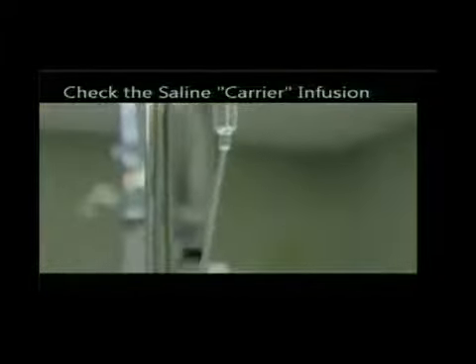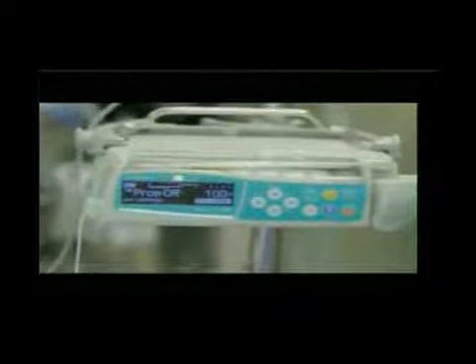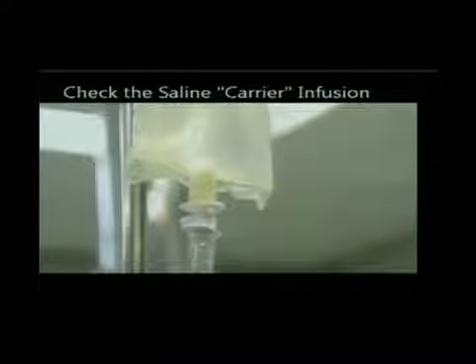Now, here's the saline carrier infusion. This is the bag that I just showed you. Remember I talked about the spike. That's the spike right there. This is the piece of white plastic that is shoved through this.